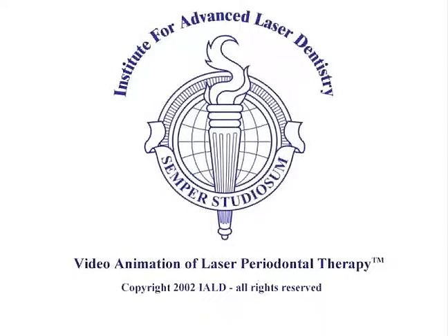This is the video animation of the FDA-cleared laser periodontal procedure called Laser Assisted New Attachment Procedure, or LANAP.